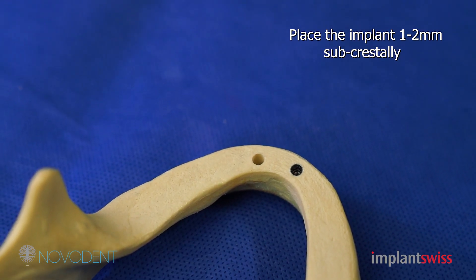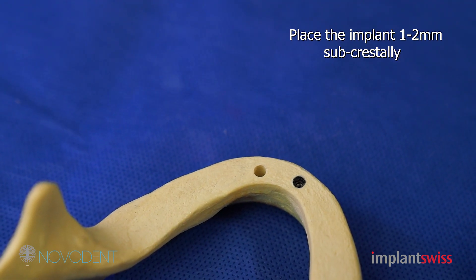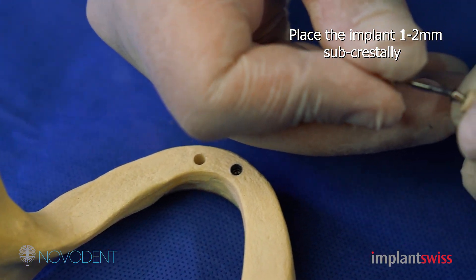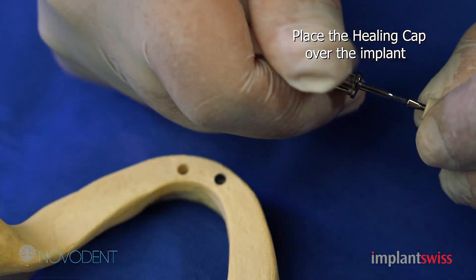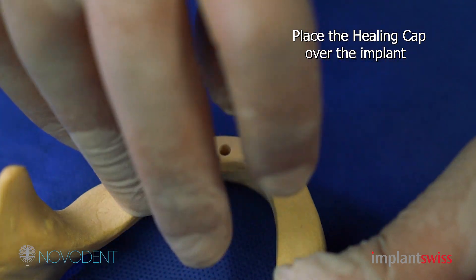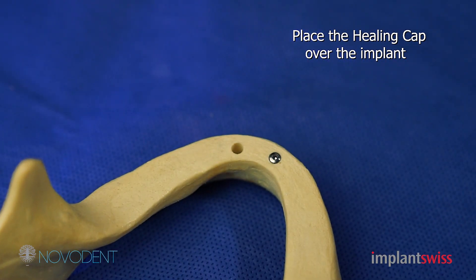After this, you will hold the vial and you will see immediately that your healing cap is inside the vial. You unscrew the healing cap from the vial, bring it on the top of the implant, screw it in, and you're done. That's it.